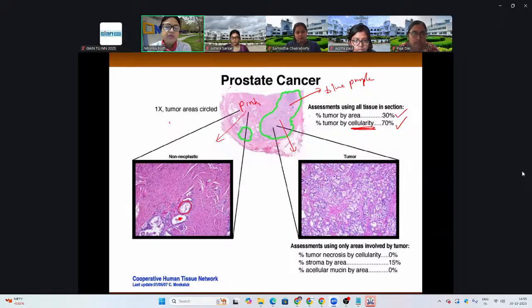If I look at this tissue, it's a very clean-looking, homogeneous kind of tissue. It has purple nuclei, but it has a lot of cytoplasm also. These are a lot of cells, so I can't tell you the direction.